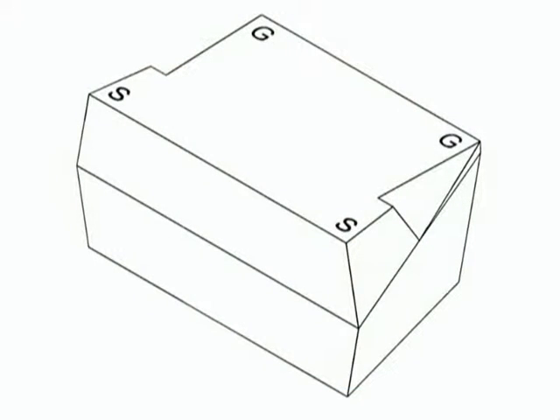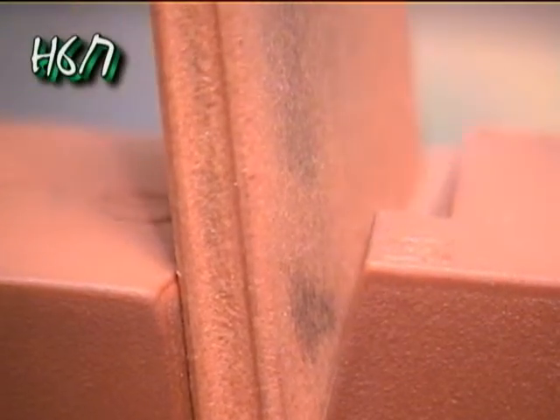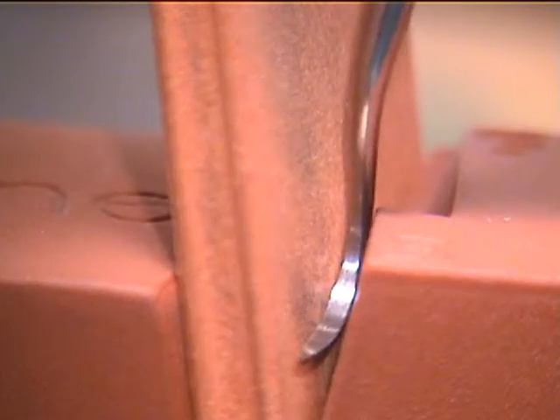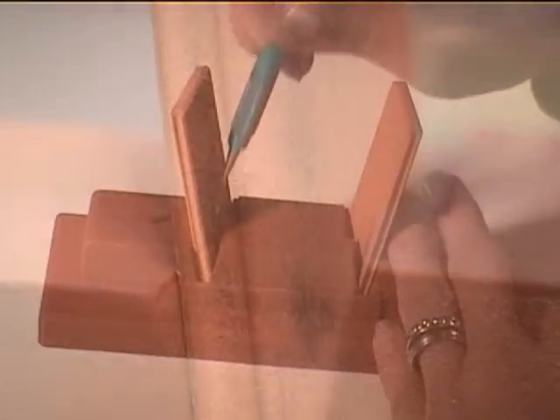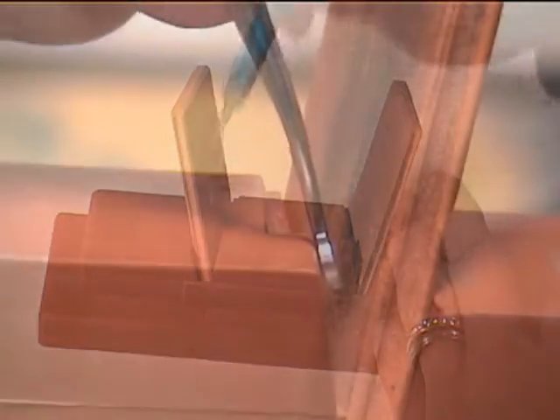Position the V-Hone on a table with its front facing you. Position the terminal shank of the H-6-7 Scaler on the S-Rest. Holding the instrument in a pencil grip, move the instrument back and forth against the Hone and hold the V-Hone steady with the other hand.